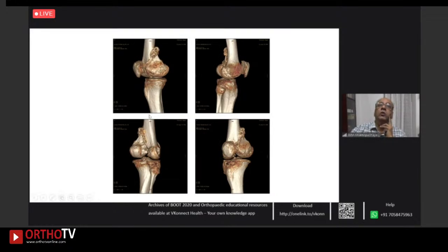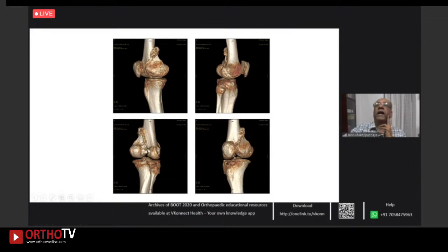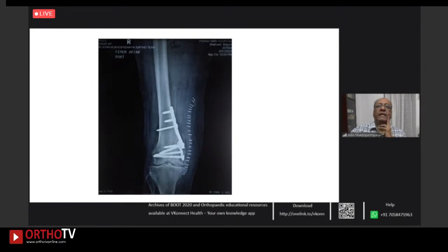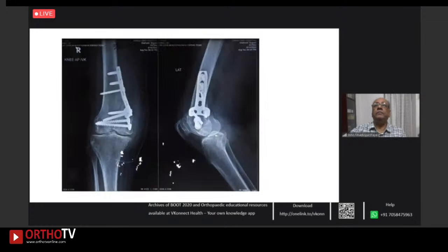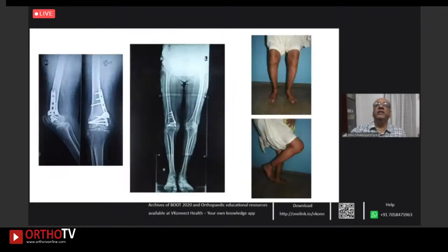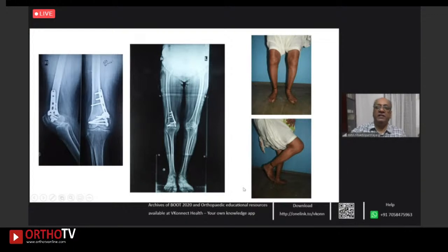Going through the previous fracture line, getting it reduced. A posteromedial buttress T-plate was used along with lag screws across the reduced fracture. At about four months post-op and one year three months post-op, the patient is reasonably well-aligned, same as the opposite side, with full extension and about 100 degrees of flexion.